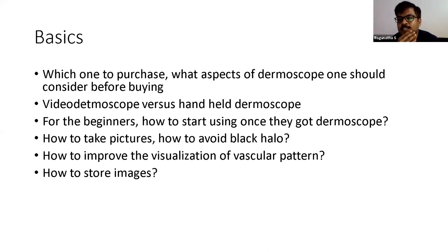One of the questions is how to store images, because we start clicking the images and how to store them. I maintain a register and I store the images in disease-wise folders. By clicking the image, we'll come to know the date and time of the image taken, so I retrospectively go to the register and check for the diagnosis. Okay. Any other comments on this? Because it is very difficult when you are seeing many patients and you are clicking many images. If you are busy, it will be quite difficult. Are there any tips for this apart from register maintenance?